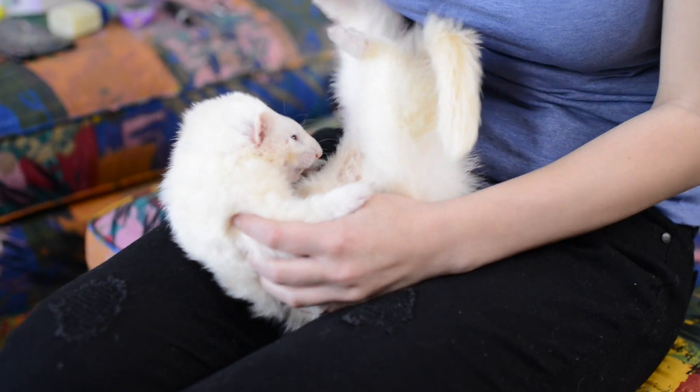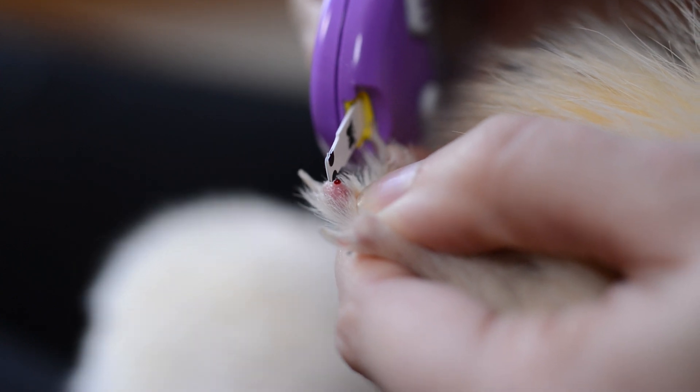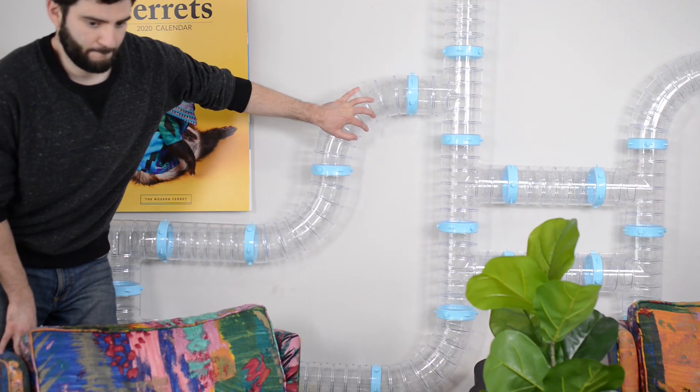This is literally impossible to use if you don't understand how to do it. Today we're going to teach you how to use the AlphaTrac II monitor to test your ferret's blood glucose levels at home. It's Haley from the Modern Ferret.